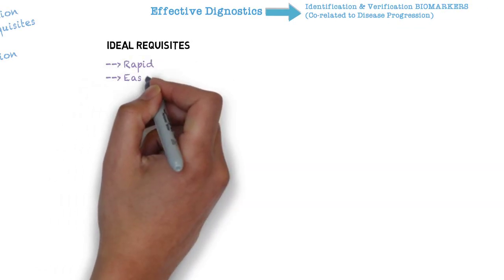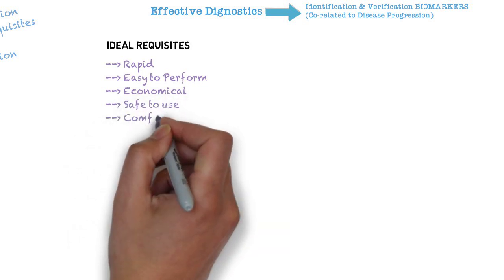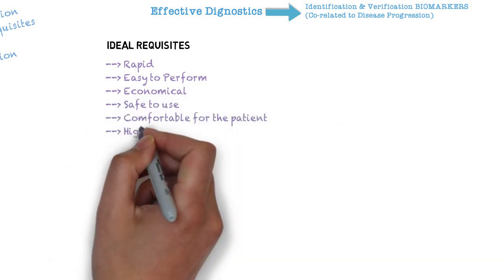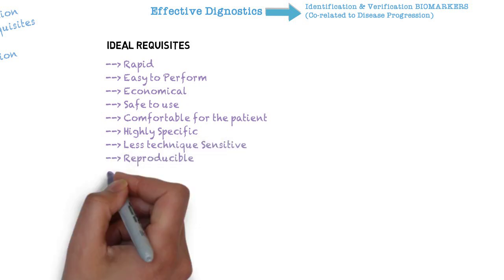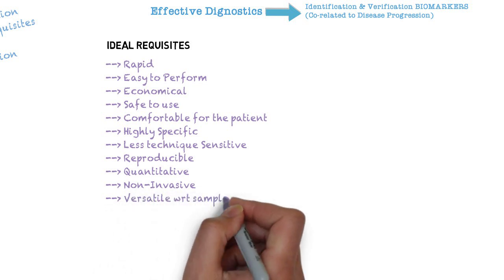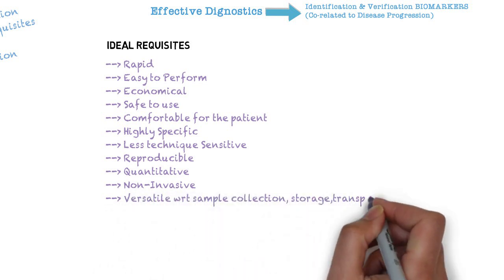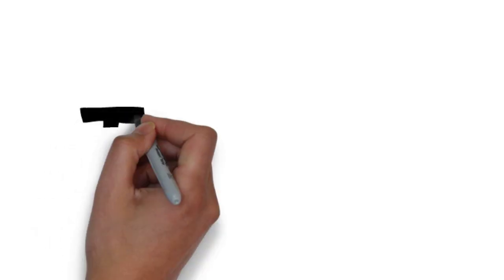They must be rapid, easy to perform, economical, safe to use, comfortable for the patient, less technique sensitive, highly specific, quantitative, non-invasive, versatile with respect to sample collection, storage, transport, and amenable to chairside use.